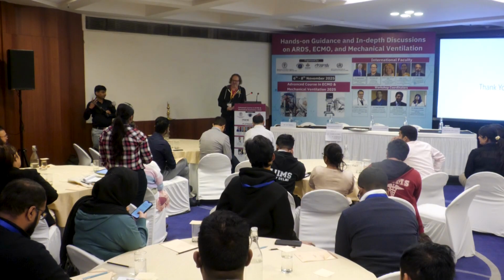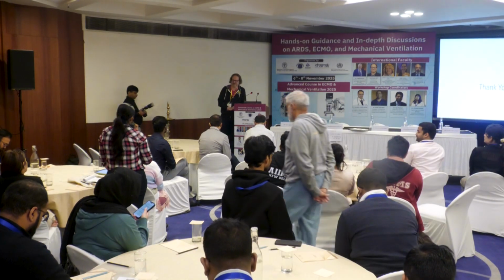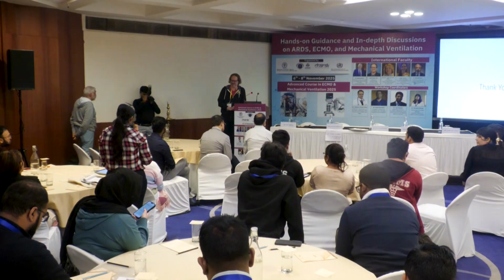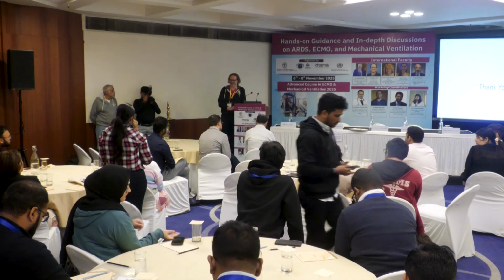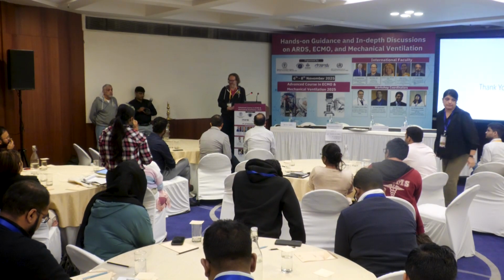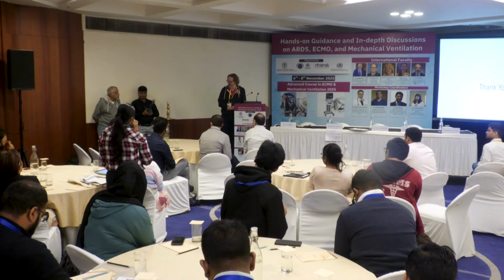I'd say probably yes. Probably echo can be sufficient if you have good operators, people who have very good experience. I wouldn't say this is for the resident learning bedside ultrasound for the first time to have the responsibility of directing catheter replacement. But if you have an intensivist or cardiologist with a lot of skill, that certainly can be done. We primarily use fluoroscopy, and sometimes we use simultaneous fluoroscopy and echocardiography. But I don't think anybody yet is doing bedside ultrasound alone.